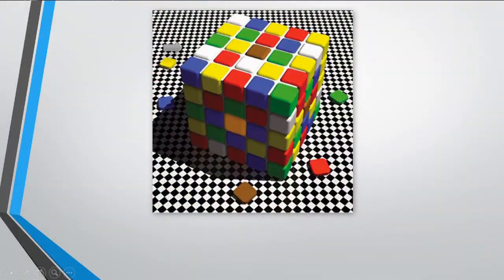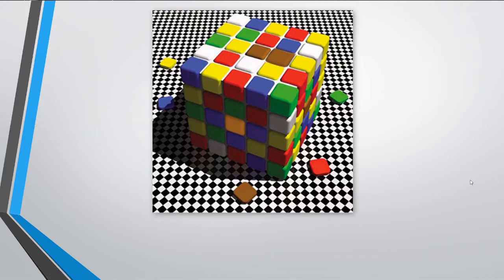When we want to determine the hue — the color — in the mouth, you can see in this picture on the lower tile you clearly have orange, on the upper you have brown. But these are both the same color. So if you compare this to the mouth again, with the tooth in the shadow and the shade tab in the light, you will pick the wrong shade for sure.